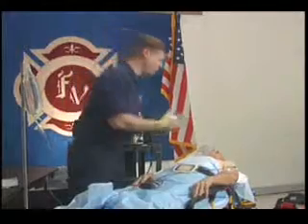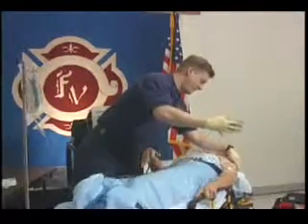Sir, can you roll towards me on your right-hand side, please? Okay, can you roll back over now?